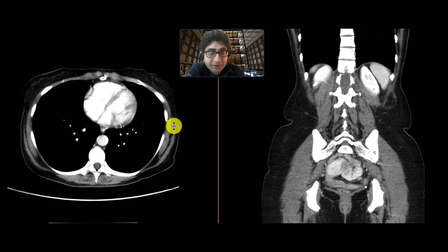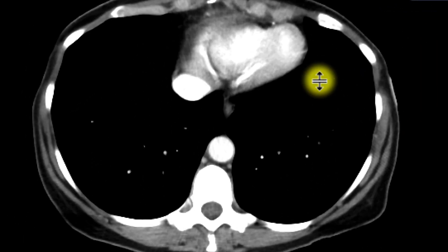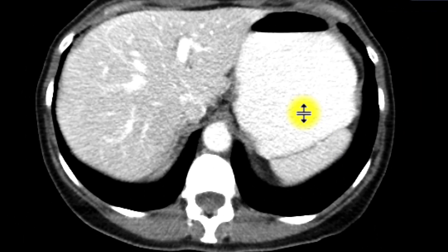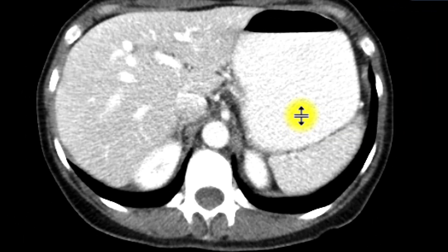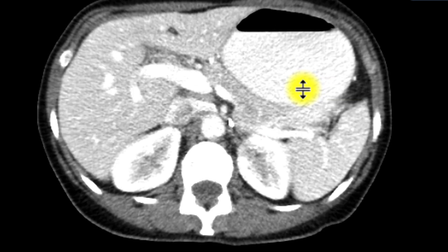This is a patient who came in with nausea, vomiting, and abdominal pain. The patient got a CAT scan with intravenous and oral contrast. As you look at the axial images, we can see pretty immediately the stomach is quite distended with the oral contrast.